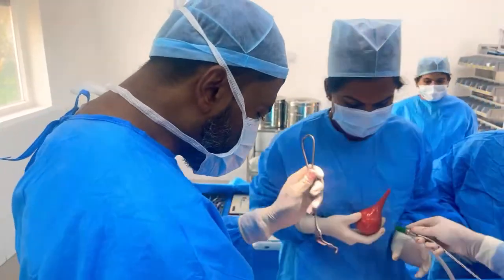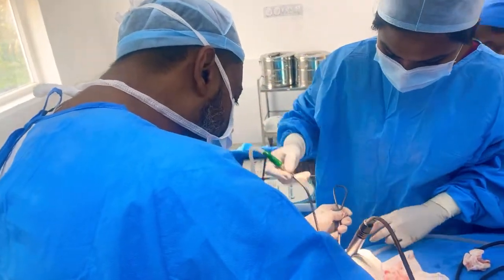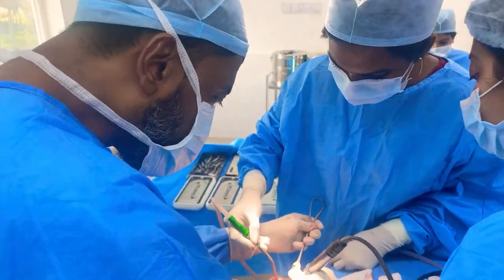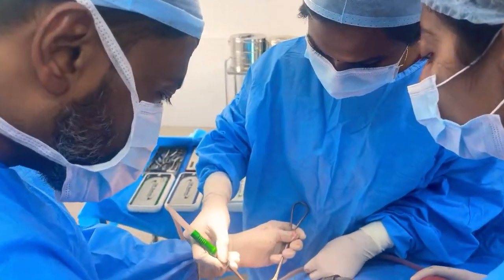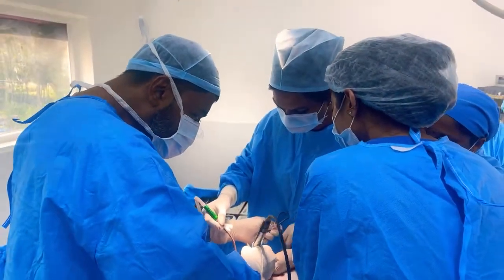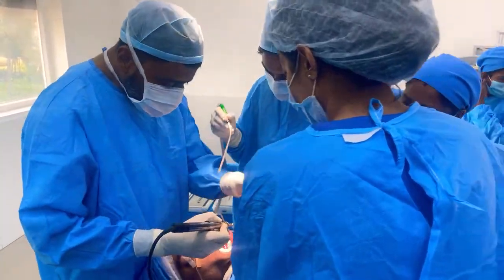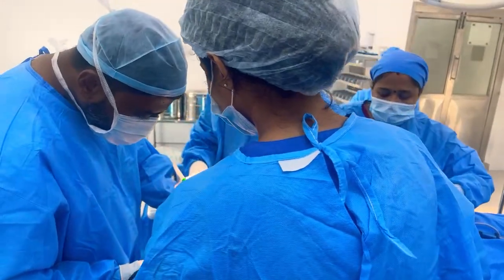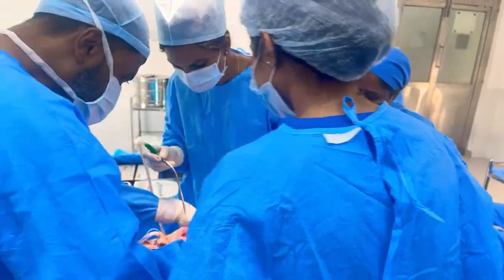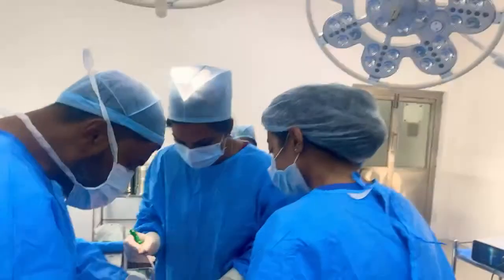So you could sculpt when you cut, you could sculpt before, depending on the need. Now in this patient, one side I'm sculpting more, the other side I'm hardly sculpting, because the patient has got asymmetry. So that's what sculpting means. It's like to shave, to carve, whatever. That's the meaning of the word. So you could do it in different stages based on what the patient's need is, and it's a part of various jaw surgeries.